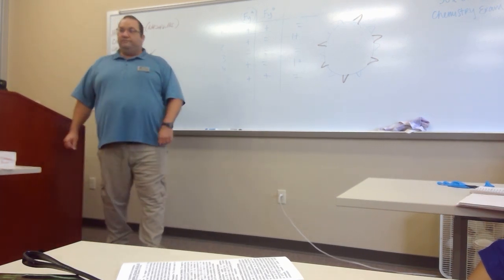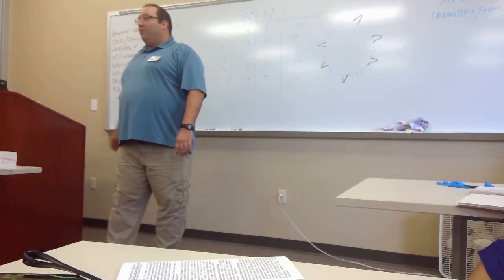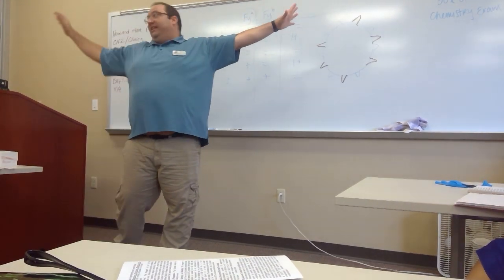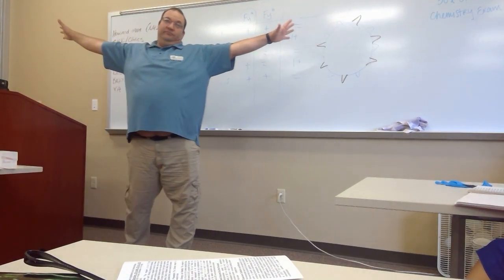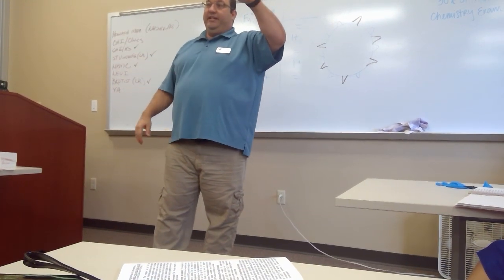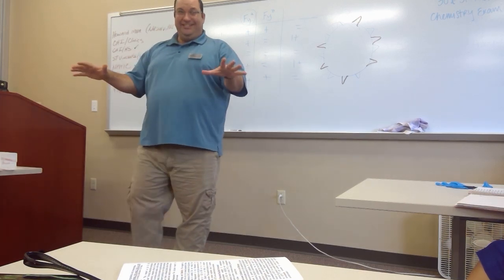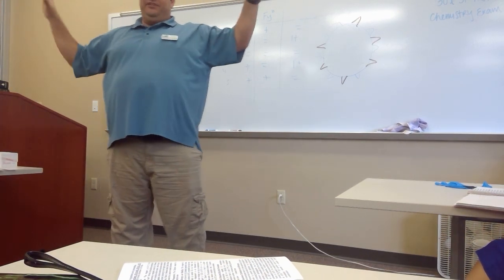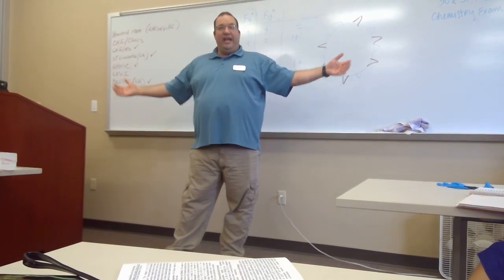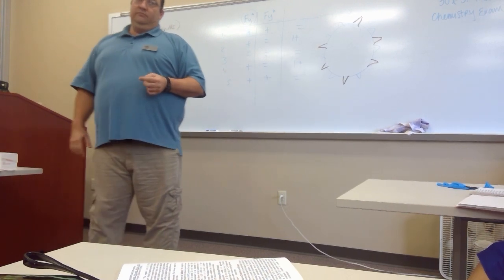You got 4 tubes that pop up positive at immediate spin, and then you got 3 more that pop up positive at Coombs. That's 2 total. That's an IgM and an IgG. So you got 2 things going on. Right. You got 4 tubes pop up positive at immediate spin, and at the end, that's still the only 4 positive. You're good. Nothing changed. But when you start getting different reactions at different phases or reactions of different strengths, you gotta start thinking they got more than one. It's not super common, but it happens.